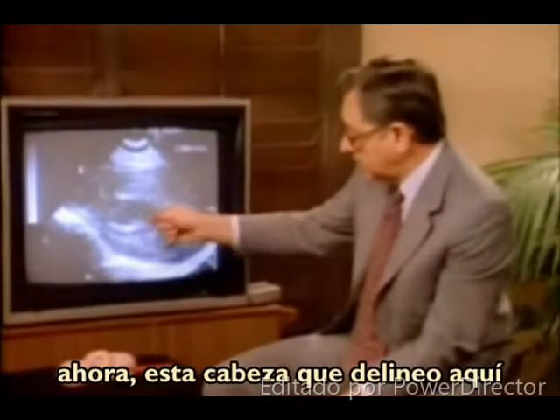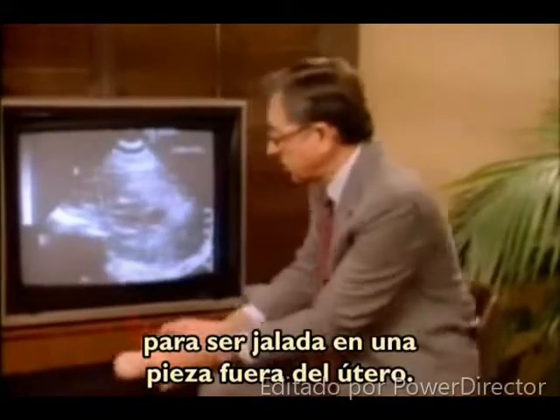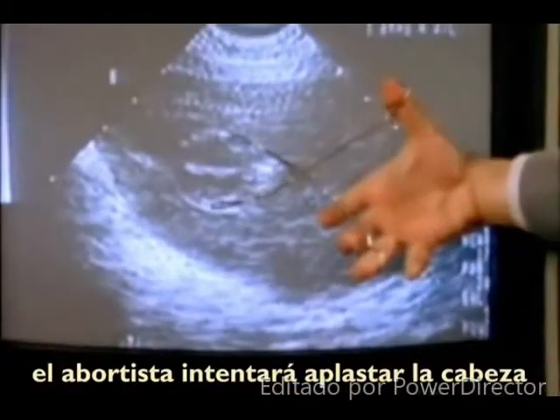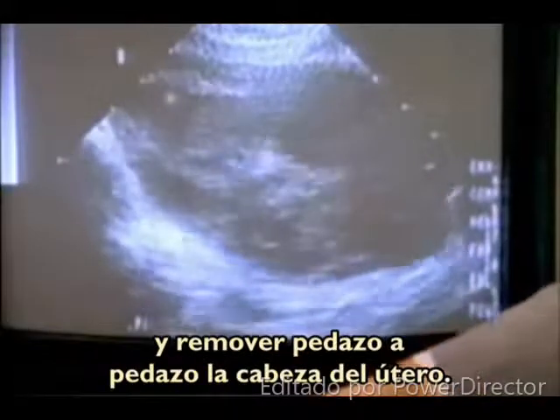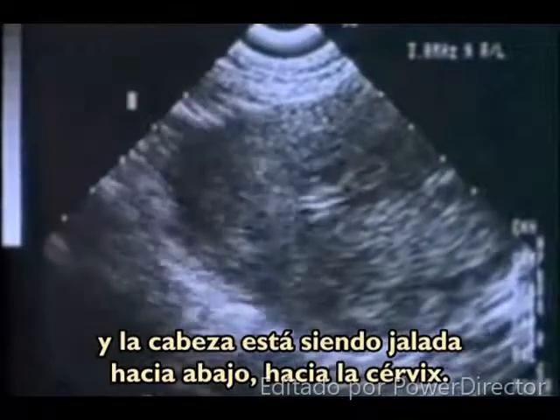Now this head, which I'm outlining here, on this 12-week child is simply too large to be pulled in one piece out of the uterus. The abortionist will attempt to crush the head with this instrument in this manner and remove the head piecemeal from the uterus. And the head is being pulled down toward the cervix.